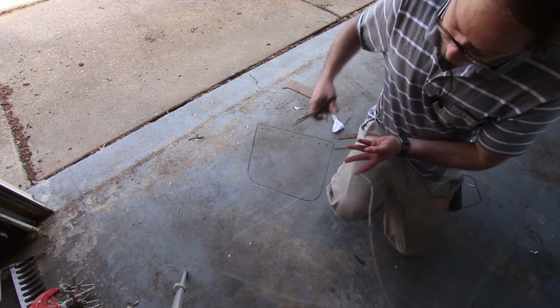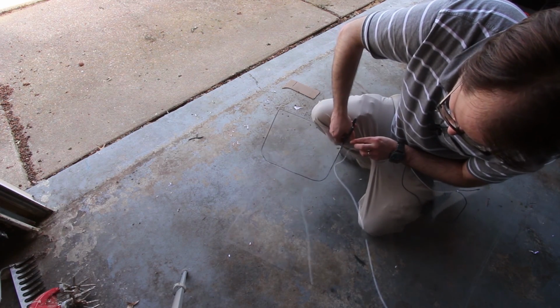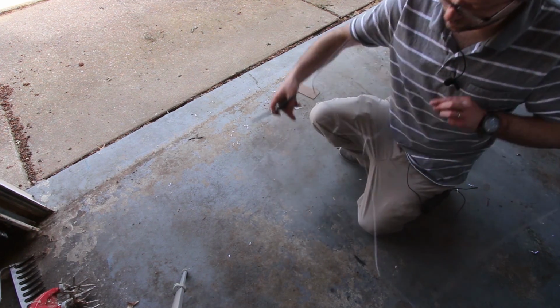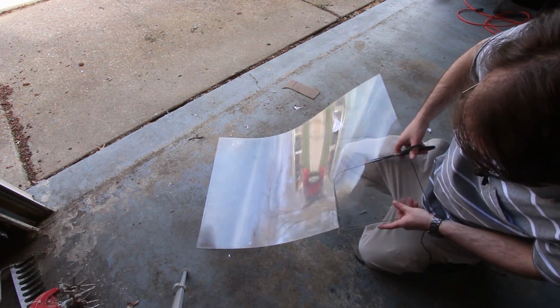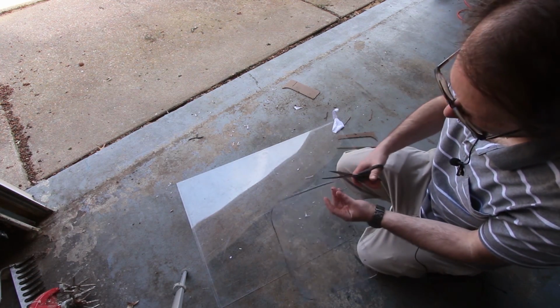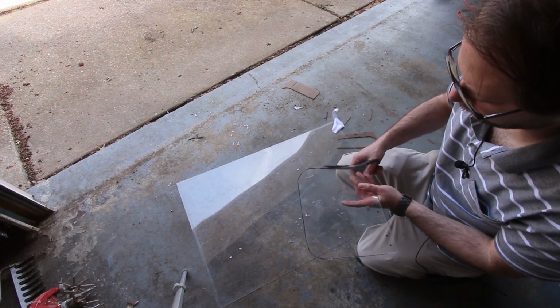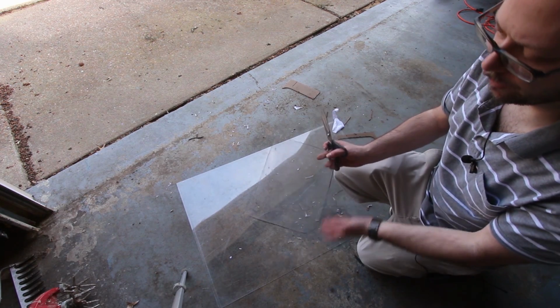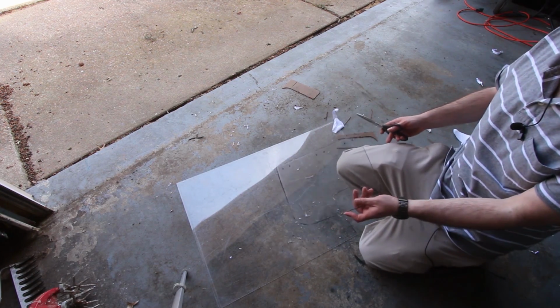Okay, so again, we would typically do this with a laser cutter, but since we don't have one of those available, we're gonna improvise here with just a pair of scissors and see how this works. We might also try an X-Acto knife, depending on how these scissors do. So yeah, you can see that the plastic kind of just wants to chip as I cut it. So we might have to experiment with that a little bit to figure out the best way. So let's go ahead and drill our holes and then see if this will attach to our visor.